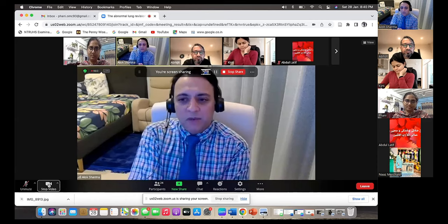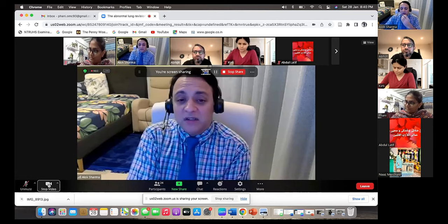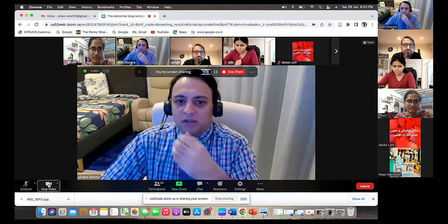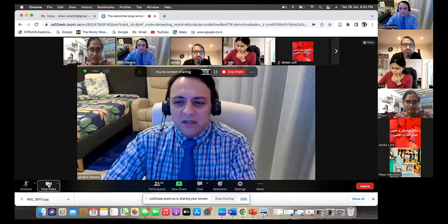It might mean you have to move the image laterally to get your best image in that situation. So you might end up getting quite a few images for R5, R6, just to make sure that you've got your image acquisition really nice. Other thing, again, as Abhijit mentioned, is that you're losing your image acquisition at the bottom.